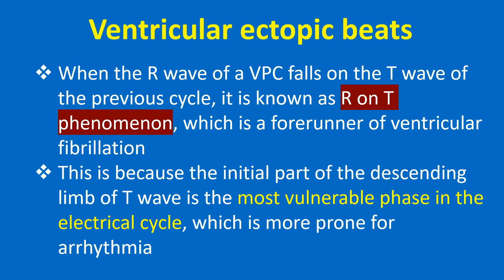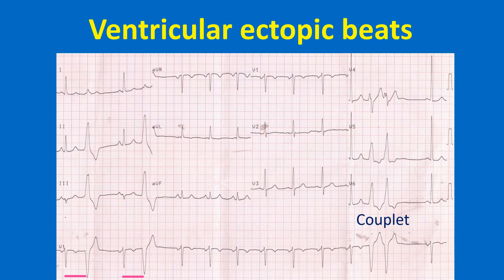This is because the initial part of the descending limb of the T wave is the most vulnerable phase in the electrical cycle, which is more prone for arrhythmia. The initial two VPCs in this ECG are isolated VPCs, while the last two occur in rapid sequence as a couplet. VPC couplets may be a forerunner of ventricular tachycardia. Isolated VPCs and the couplet are followed by a compensatory pause.